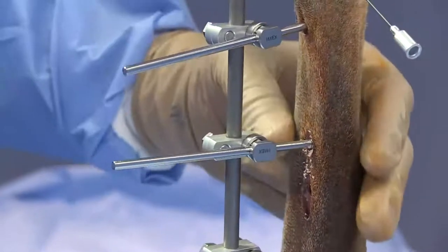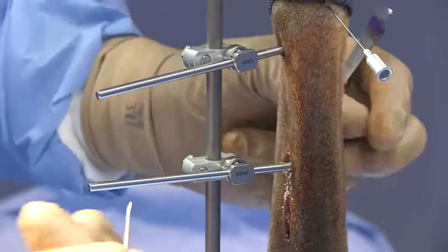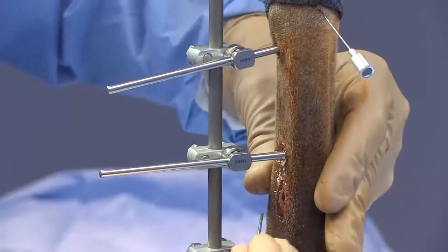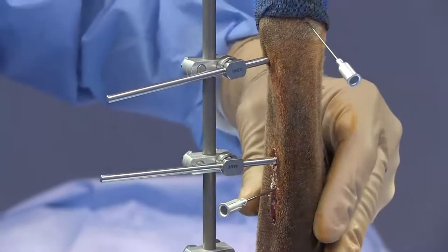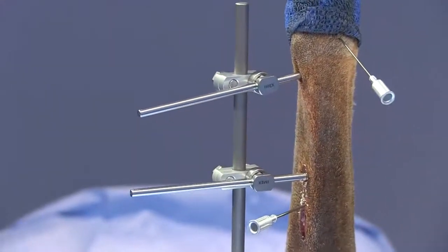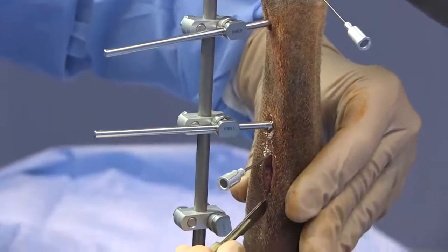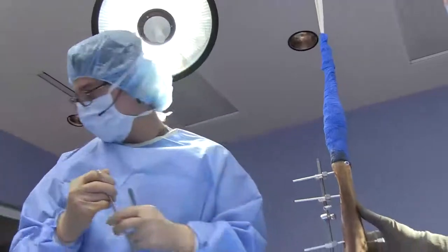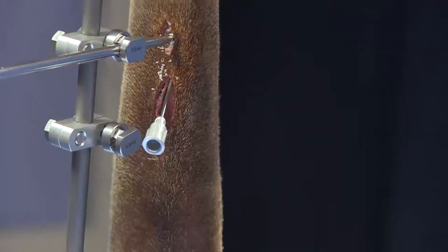If you're done assessing the mini approach, now wouldn't be a bad time to close it. If you want to keep that portal open to reassess things once the last pin is in, that's fine too. As you're getting these pins placed, realize it's going to be a little more difficult to close that site — and you certainly don't want to leave it open if it was a surgical incision. We'll place our feeler needle right there and make another releasing incision close to the fracture site, which might be part of the initial mini approach. This is also a good time to mention the positioning of the clamps — especially if you're doing pre-placement.